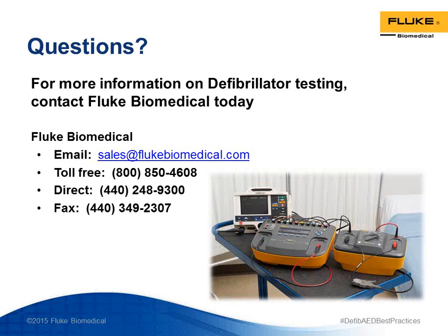Fantastic. How can one tell the difference between an Impulse 6000 and an Impulse 7000? The Impulse 7000 includes the Pacer connection post and Pacer test selections. The Impulse 6000 does not. As well, the Impulse 7000 can be used with the 7010 external load accessory box, which allows you to test more impedance levels. The 7010 load box is not compatible with the 6000, only the Impulse 7000.